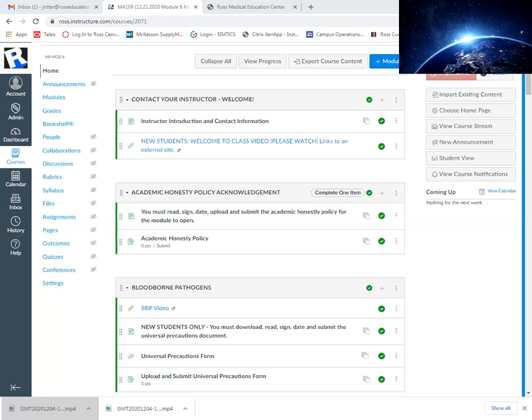Things that we need to keep in mind while proficiencies are being done and while preparing for proficiencies: we are going to be always using safety needles. No needle without a safety feature is allowed in Ross. We are going to be checking equipment, making sure that the centrifuges and the hemoglobinometers are in good working condition, and that we have all the supplies we need for these tests that are current and not expired.